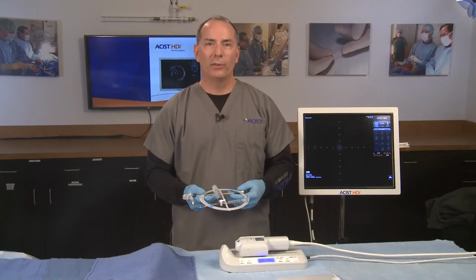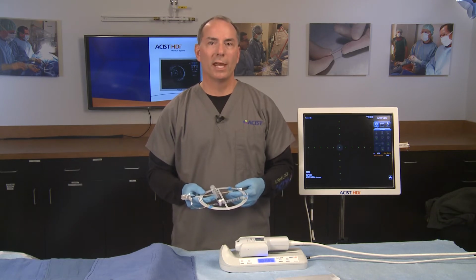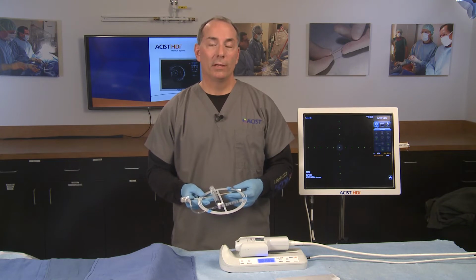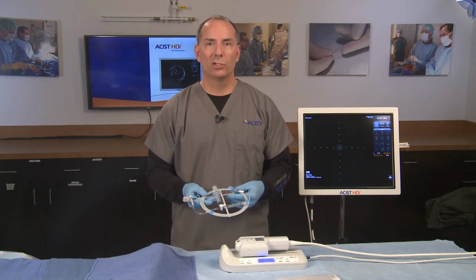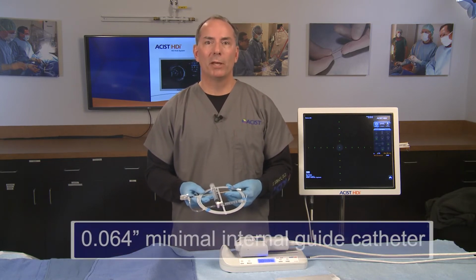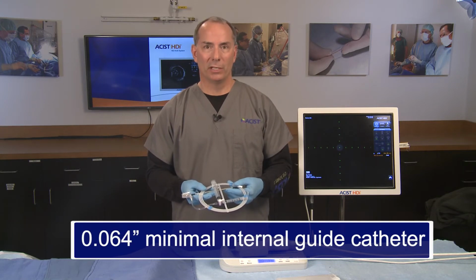The Kodama catheter is to be used in conjunction with standard protocols for coronary cannulation. It is designed for use with a 0.014 inch diameter guide wire approved for intracoronary use and an approved 6 French to 8 French coronary guide catheter with a minimal internal diameter of 0.064 inch.